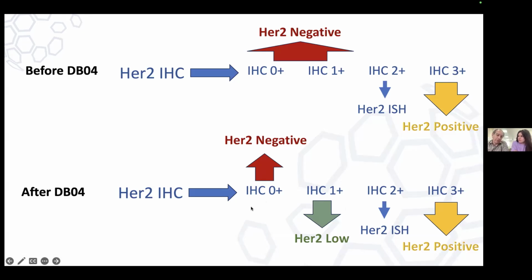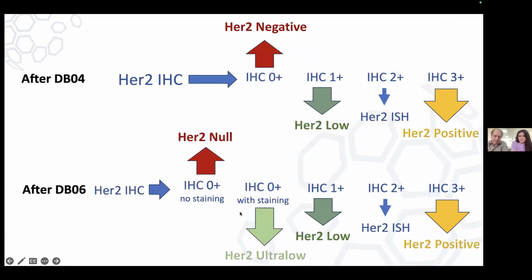And my approach to this has always been, the problem is there because we don't tell each other exactly what the rules are to diagnose these categories. And so we started to do a little bit of work in tidying up these diagnostic categories so that, and some of you have already been in some of our workshops, everything is quite schematic. There is an interpretation algorithm. And if you do follow the interpretation algorithm, the concordance rate comes up a lot.